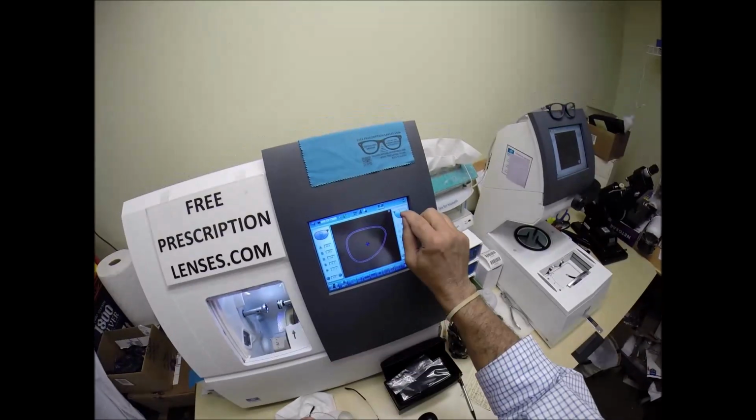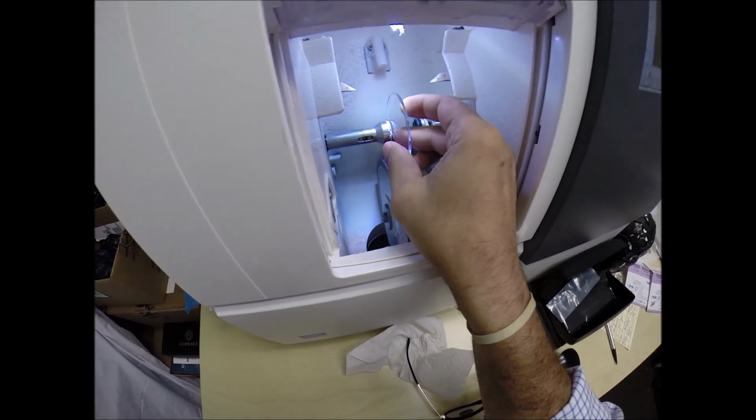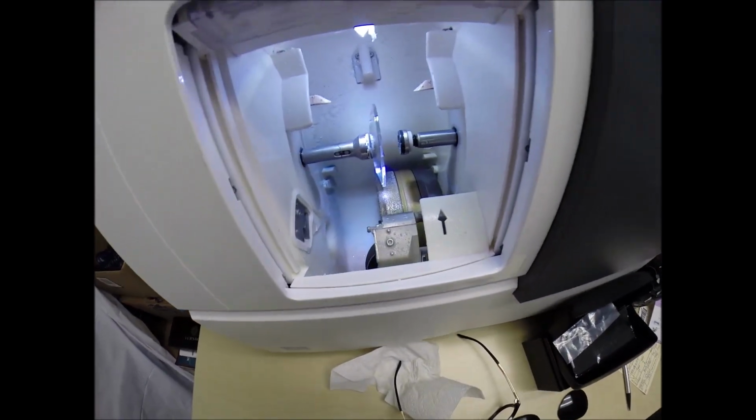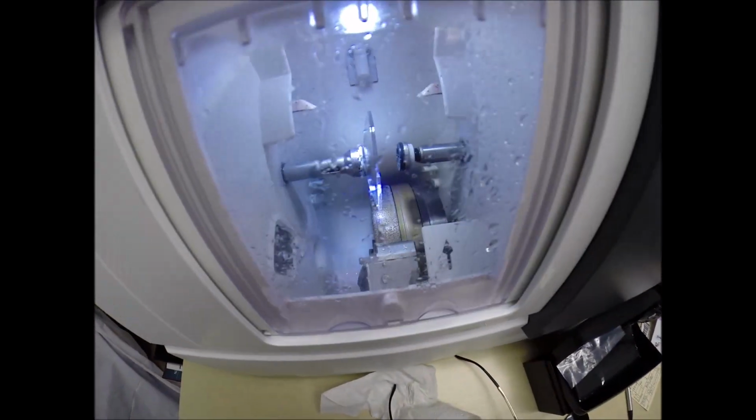Let's go ahead and take the left lens, flip that over to L, line up the magnet there into the chuck, the Charles, the Chucky baby, the CC, the C-Rock, the Chi-Chi, Dr. Chi. Hit the green arrow to start in every language.